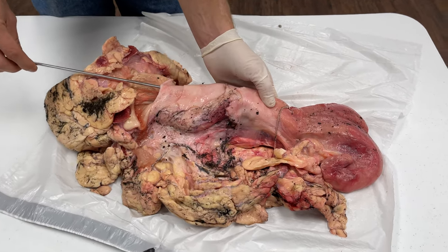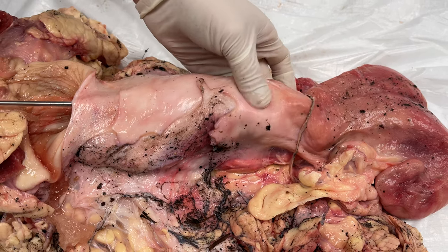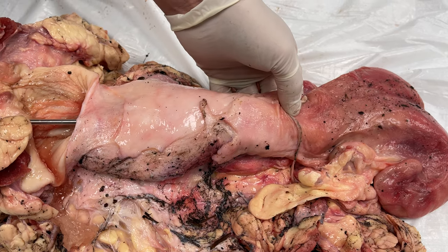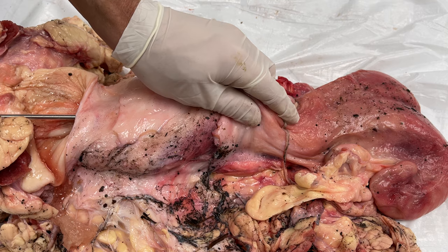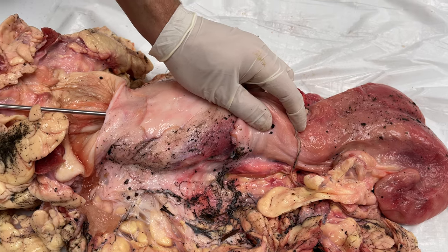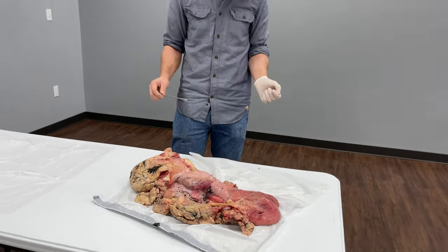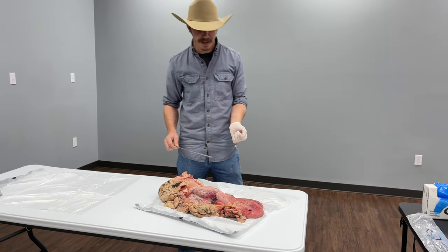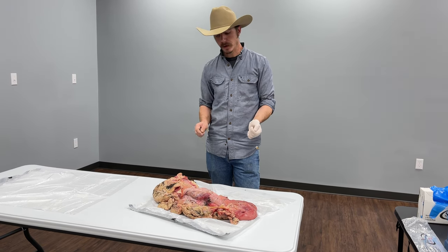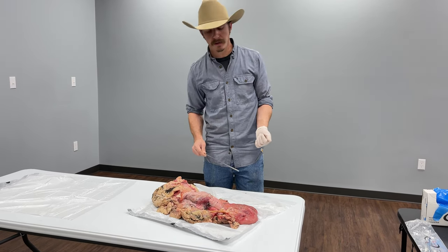I've passed all the way through the cervix. You can actually see the rod hitting the uterus up here. Right at the end of that cervix, where the rod is just barely starting to make an appearance, you want to feel that with your hand. You'll feel the rod tipping your finger just past the cervix, and that's actually where we want to deposit the semen — just outside that cervix. Then she's hopefully bred, and 283 days later you'll have a calf. That is the process for passing the rod through the cervix on a track.